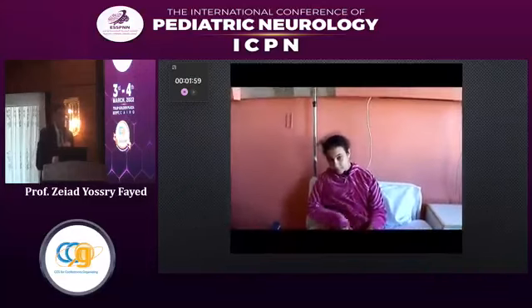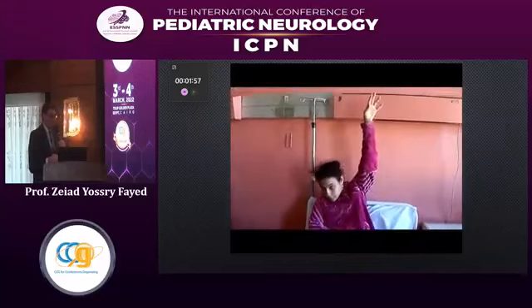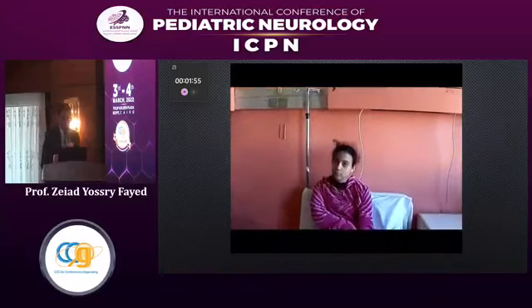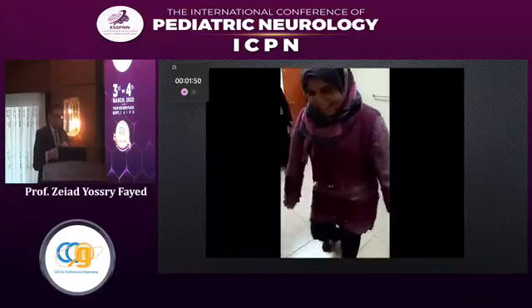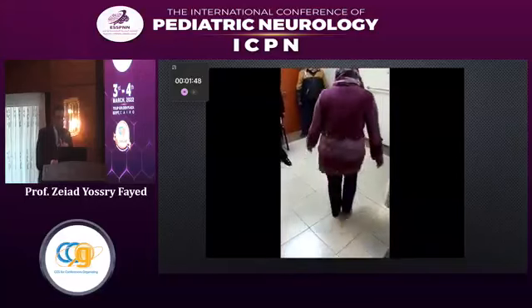This is another patient who had progressive childhood onset dystonia for 8 years before she presented to us, with limb dystonia, cervical dystonia, and trunk dystonia. And she had deep brain stimulation, and she showed very, very good improvement after surgery.